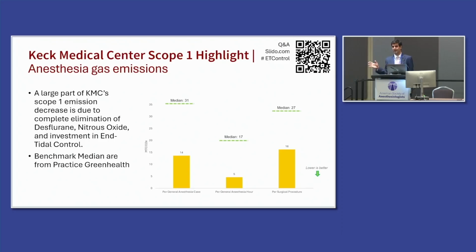And almost all of this is anesthesia related. We removed desflurane. We're a fully nitrous oxide-free institution, cylinders or central supply. The only exception is electrophysiology, which uses it for ablation. And then the end-tidal control program. So all of these combined have really helped drop us, and this is what our C-suite folks love to see.